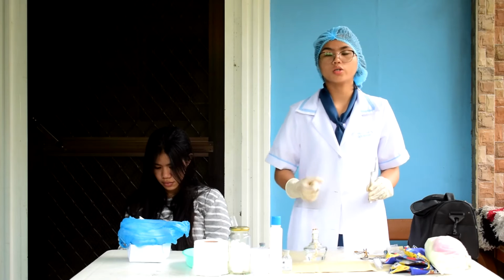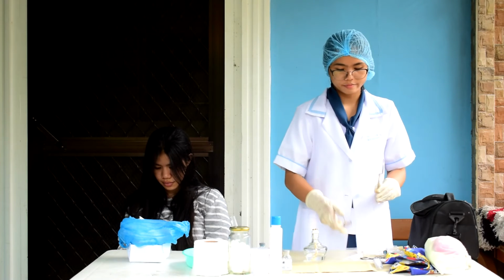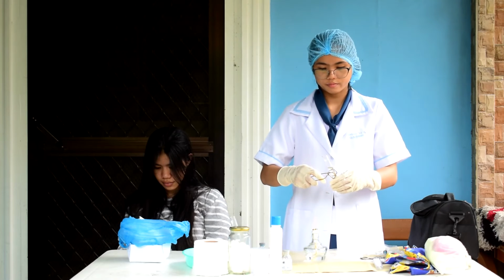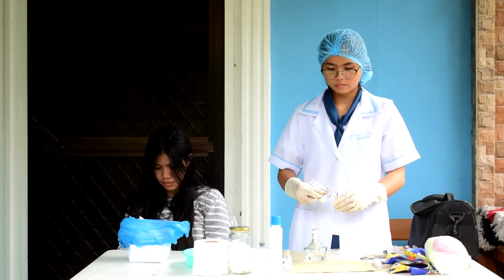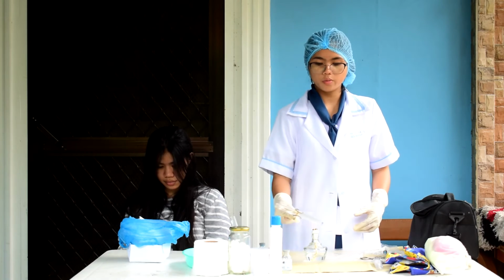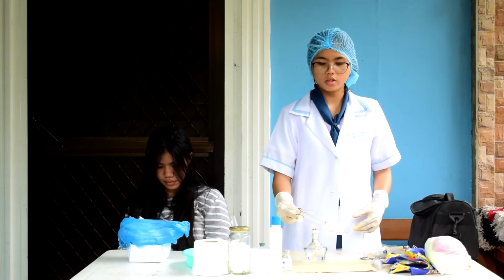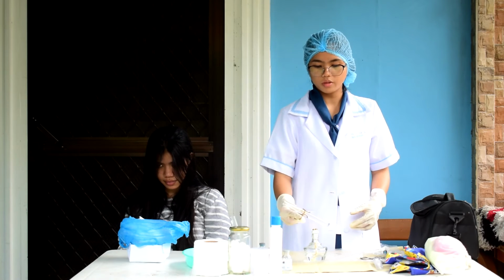So, what do you do after that? We have to be careful when using the test tube holder. You only have to heat the upper portion approximately 1 to 2 minutes until it boils.